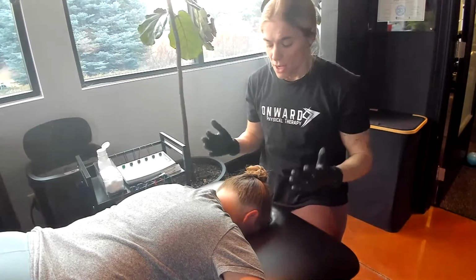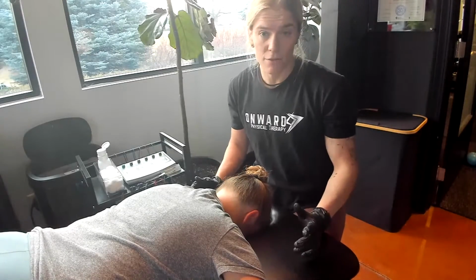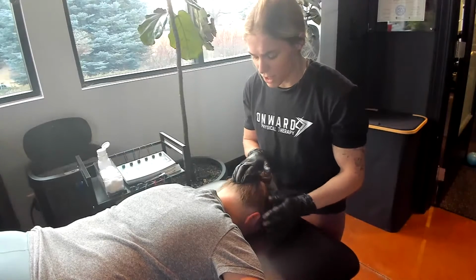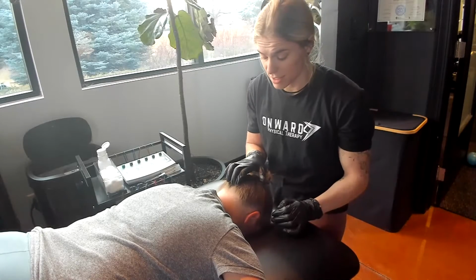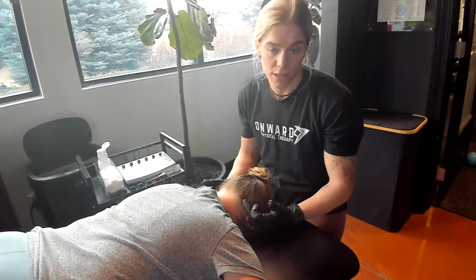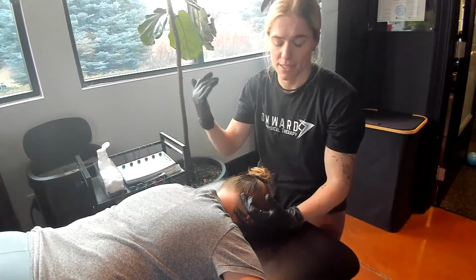of their occiput. So before we dive in, first of all, I have already cleaned the tissue of my patient here, but let's orient ourselves to the anatomy of this occipital area. So in order to do so, we are going to start by palpating for the external occipital protuberance, which is the nice bump on the back of our head here. So that's going to give us that orientation of where that superior nuchal line is. Okay, superior nuchal line is going to be the superior border of those occipital insertions of upper trap and semispinalis.